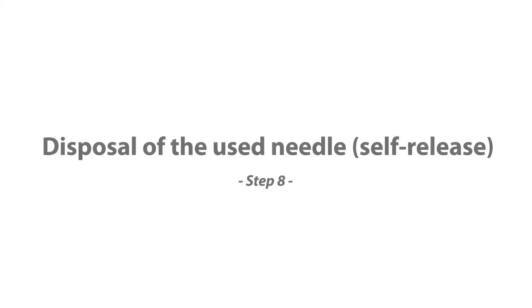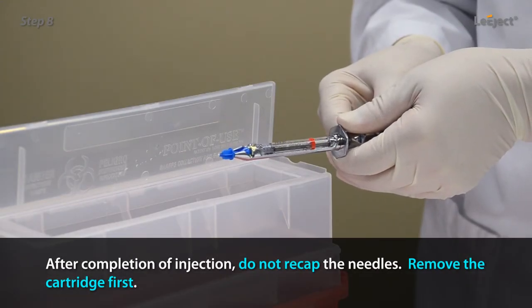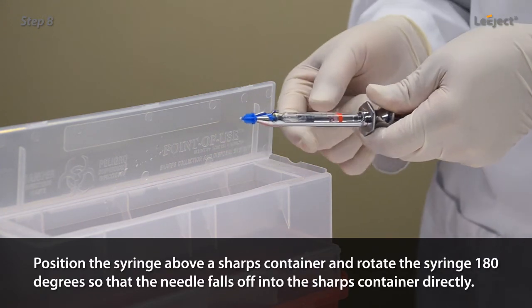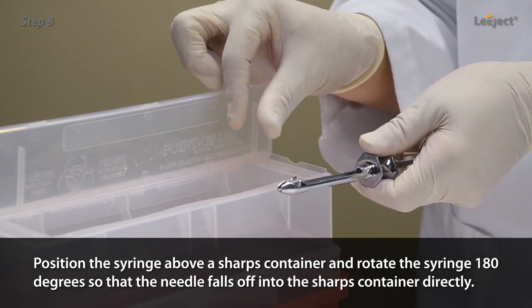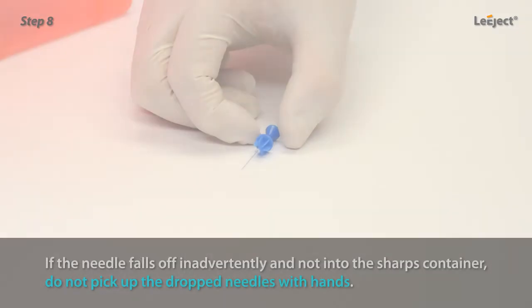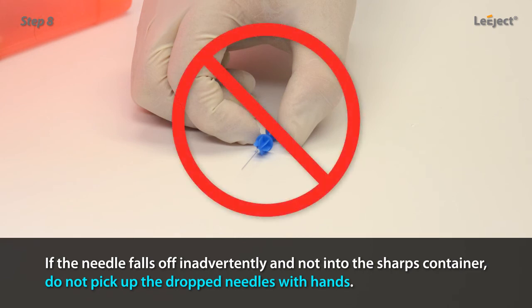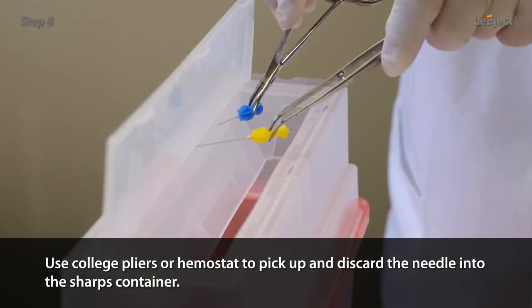Disposal of the used needle — self-release: after completion of injection, do not recap the needles. Remove the cartridge first. Position the syringe above a sharps container and rotate the syringe 180 degrees so that the needle falls off into the sharps container directly. If the needle falls off inadvertently and not into the sharps container, do not pick up the dropped needle with hands. Use college pliers or a hemostat to pick up and discard the needle into the sharps container.